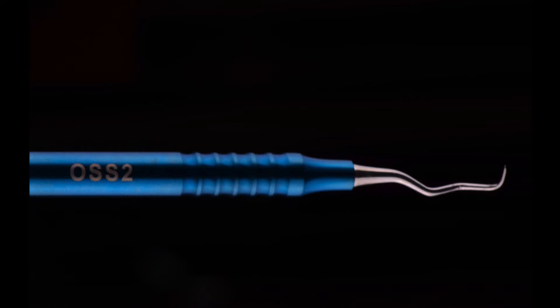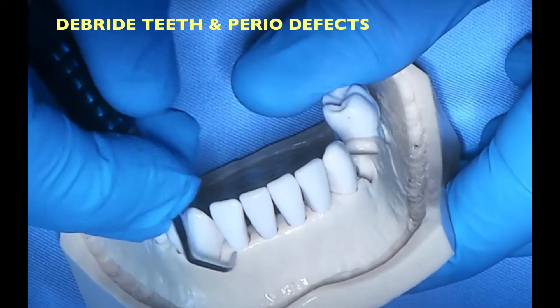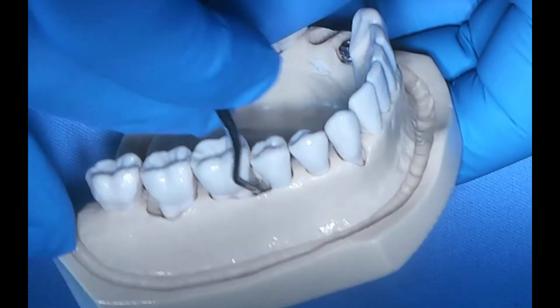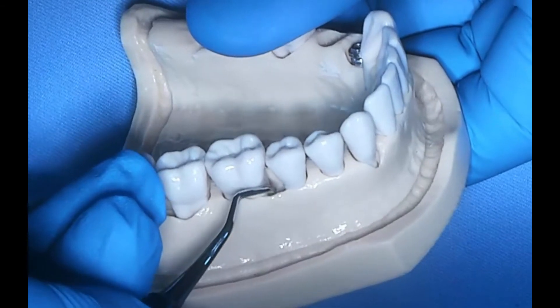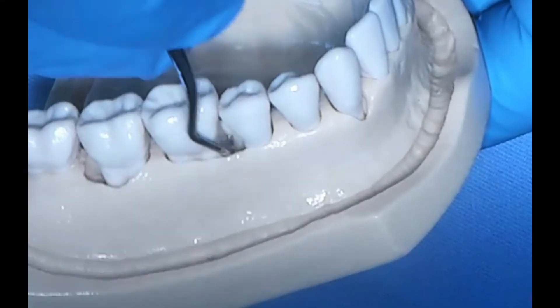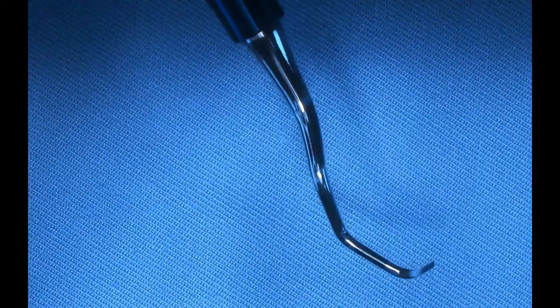The second instrument is also a curette — a Gracey 13-14 posterior curette. It has a smaller end, and I use it for debridement as well. I can use it in smaller defects, it's easy to access around line angles, and I use it quite frequently — almost like a debridement tool to scoop out granulation tissue and infection from around the teeth. Both curettes are used very frequently in periodontal surgery and both need to be sharpened before surgery. An instrument needs to be efficient, and a curette needs to be sharp.